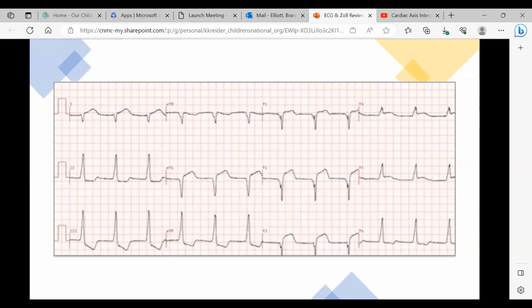Hold on. There used to be a way to do a pointer. Oh, annotate. Where's the annotate? There you go. Circle the bunny ear. I'm trying, but the bunny ear doesn't want to be seen. Yeah, if you undo, the notch. It's almost like in V1 there are 2 downward deflections. I guess it's just a little blurry.